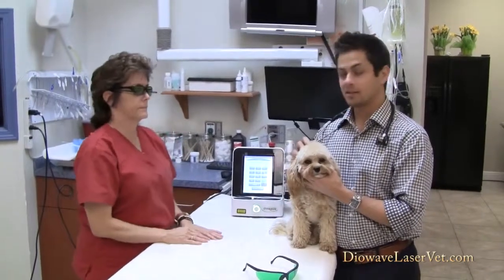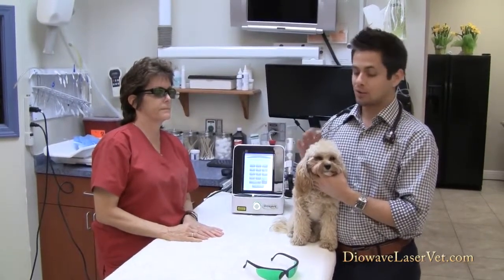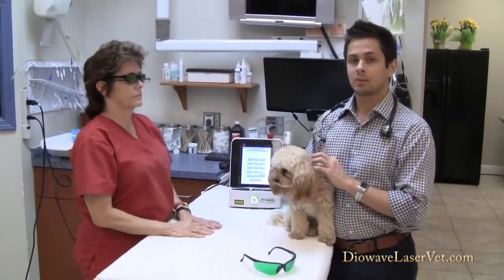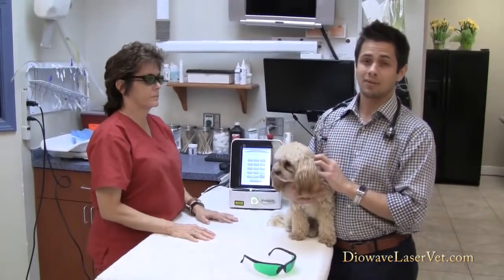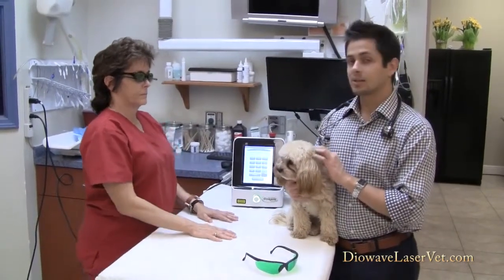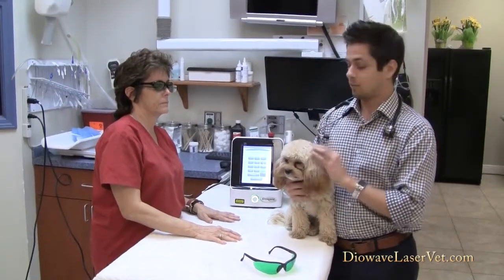Ginger is a 1-year-old Cavapoo, and she has sprained her neck and potentially pinched a nerve in her neck, so she's exhibiting some discomfort. When we treat those, usually we want to use a couple of different things: anti-inflammatories, some pain medication, and also laser therapy. Laser therapy is really important in the multimodal approach. It has no side effects in regards to liver and kidneys, where some of the other drugs do. And it does seem to help us get resolution of clinical signs and discomfort relatively quickly.